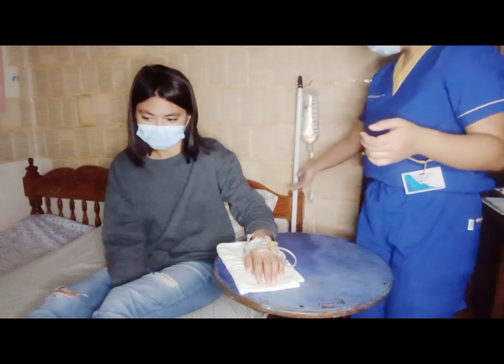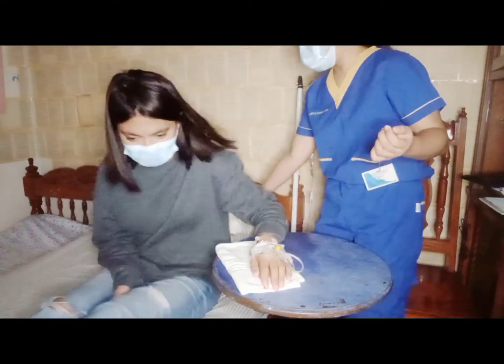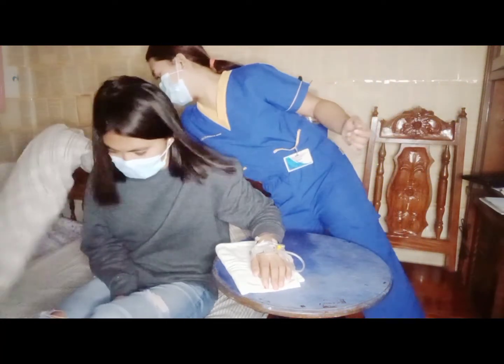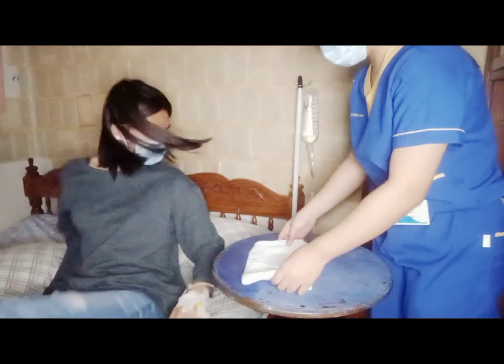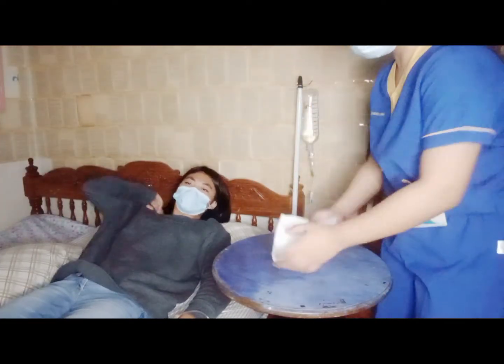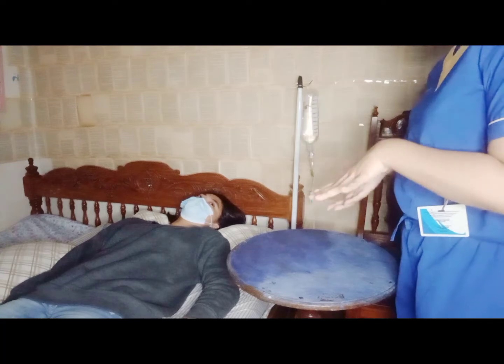Okay, so, gusto niyo po bang humiga, ma'am? Or umupo na lang po? Higa na lang po, ma'am. Okay. Pwede niyo na pong ibabaon yung inyong kamay. Ganyan, dahan-dahan lang, ma'am, ha? Sa paggalaw, okay? So, punta po muna ako sa labas. Magdo-document lang po ako ng procedure natin for today.